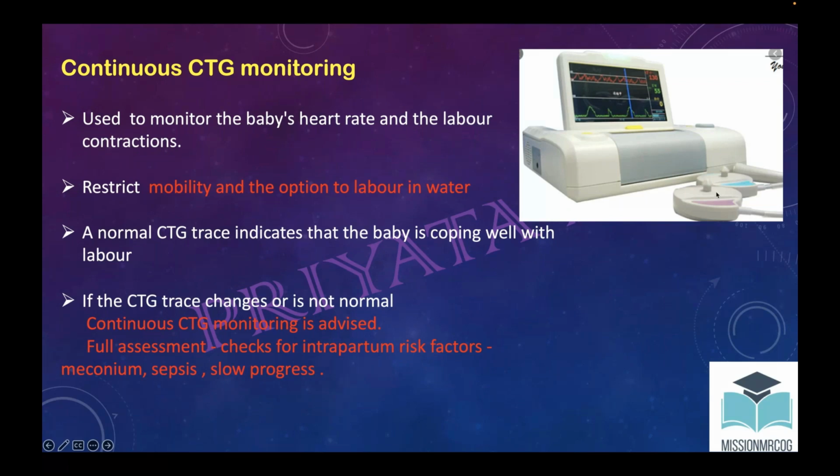these are the transducers. They will be attached to the maternal abdomen, and if the mother feels fetal movement, she will press this knob. Okay, and here we get the heart trace, and these are the contractions. So this is the tocodynamometer. On the mother's abdomen, the mother has to press if she feels movement, and here the fetal heart is recorded. This is the fetal heart, and this is the contractions. I'm not explaining further because you all are using this.